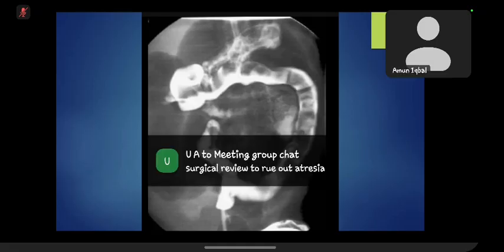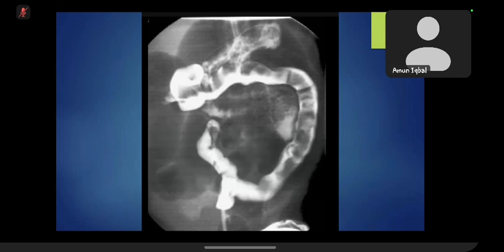Yes, excellent. So you will convey that we tried to relieve it, but it was not relieved, and they can wait for about 6 to 7 hours until the baby passes stool and there is no further abdominal distension. But if the baby again has abdominal distension and it is not relieved, and you tried once, then you need to intervene and try once more to relieve this kind of ileus in the baby setting.